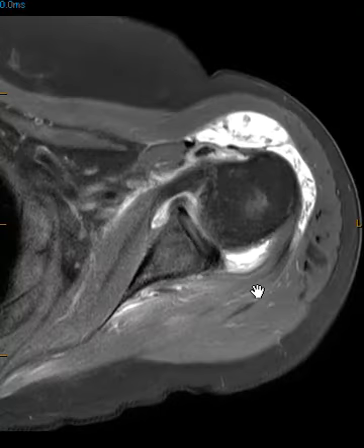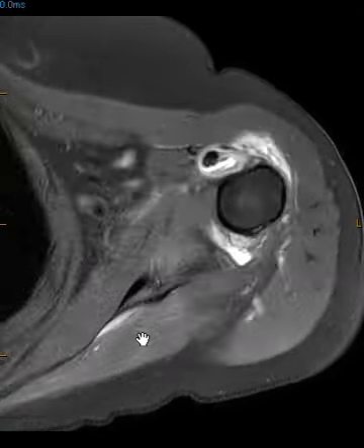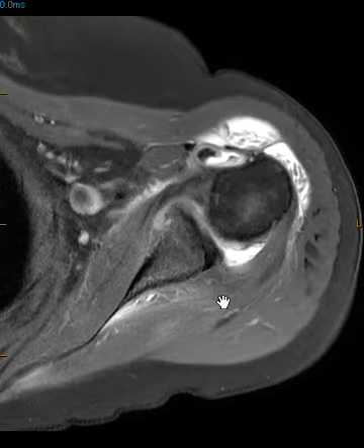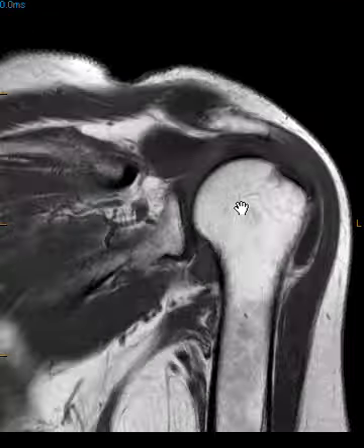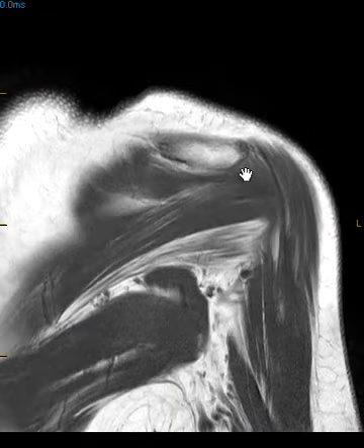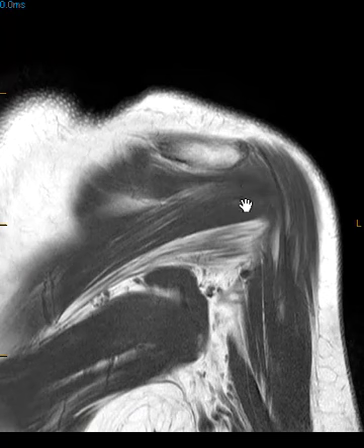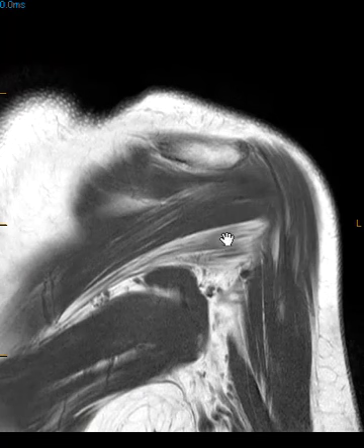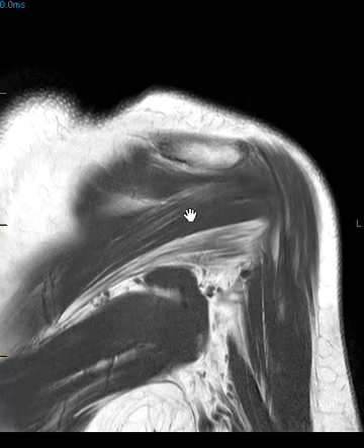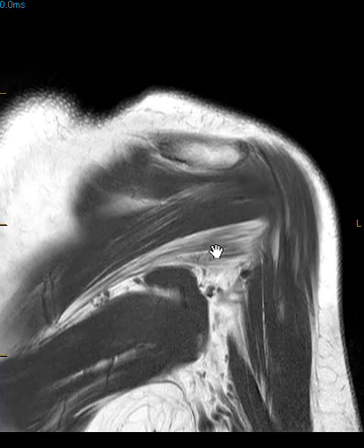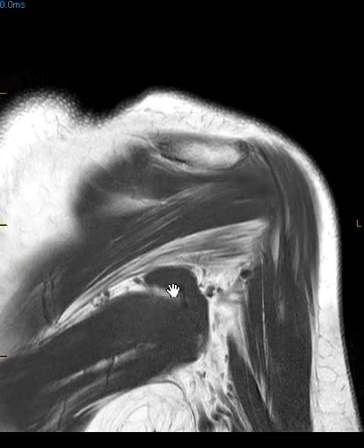This is one of the larger interstitial tears I've seen right here. Going down, the teres minor is in this region. On a coronal view, you can see the teres minor is severely atrophic — fatty atrophy — on this T1-weighted sequence. This may be related to an old neurologic insult; we see this frequently and call it quadrilateral space syndrome, though in this patient it's probably just incidental.